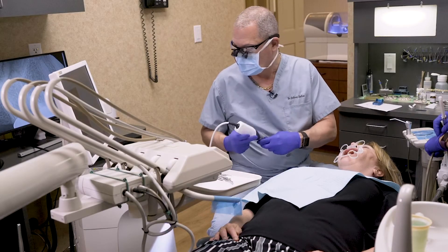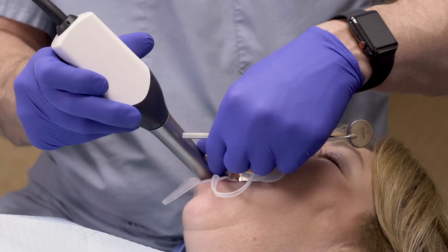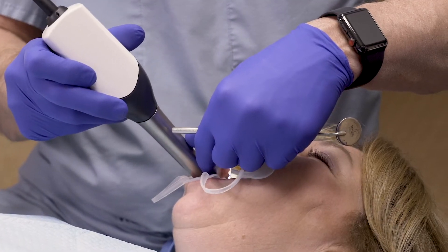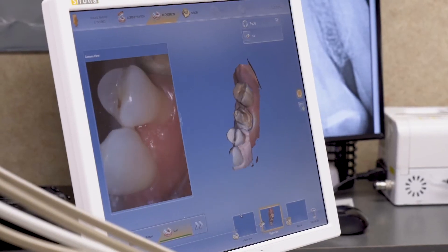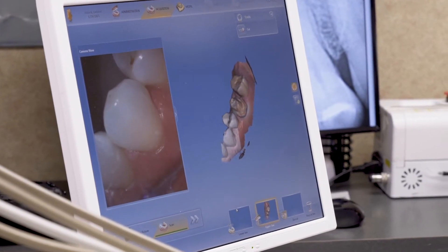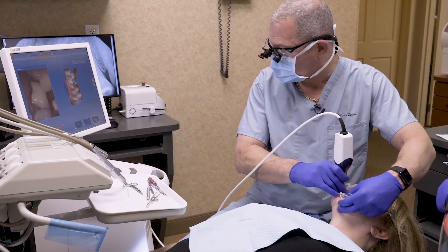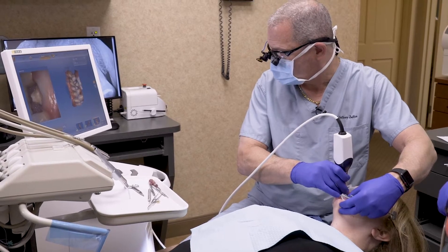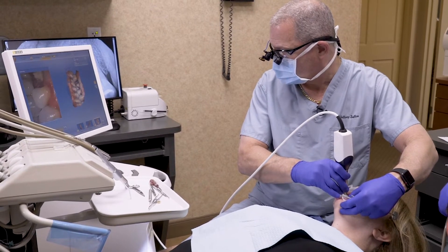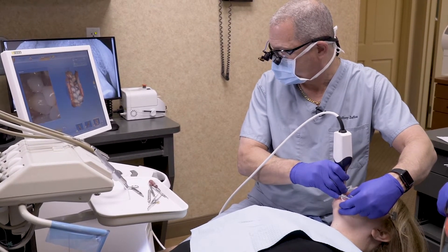Then I take my CEREC camera and scan the entire quadrant, the opposing occlusion, then I get a buccal bite — basically, the teeth closed and the camera scans the buccal surfaces of the teeth. At that point, all my data gathering is done. Once the data gathering is done, the patient can sit up and rinse out.